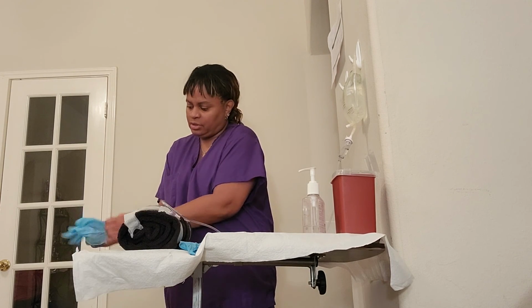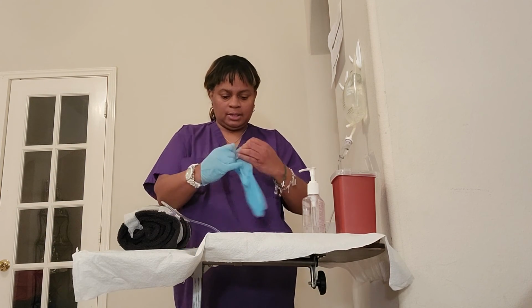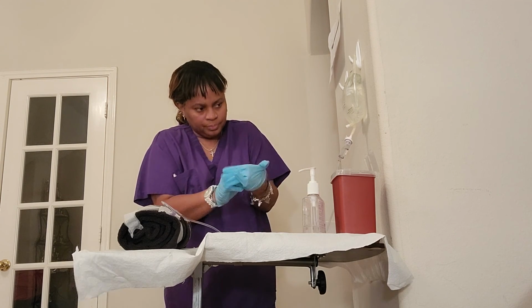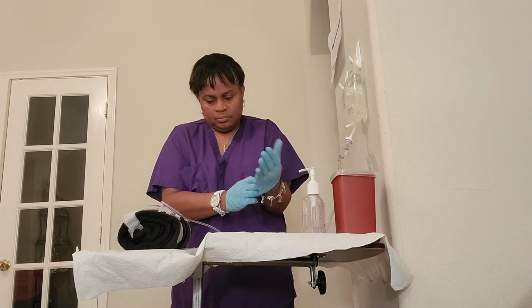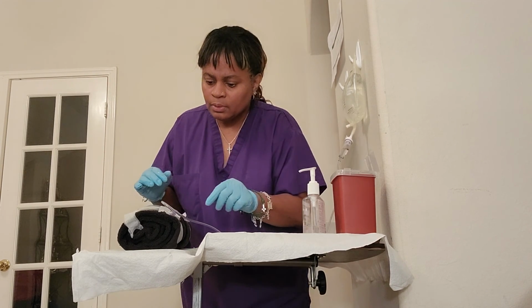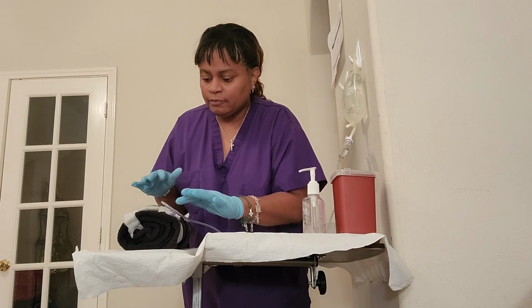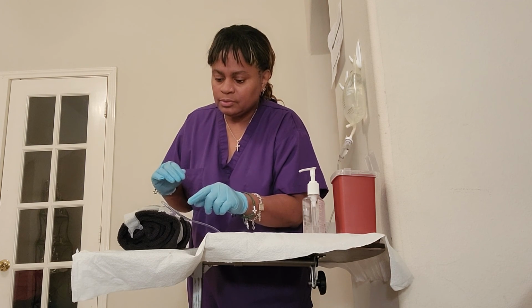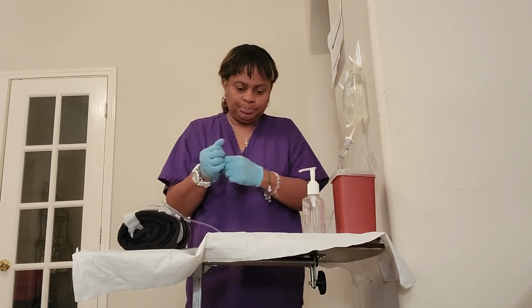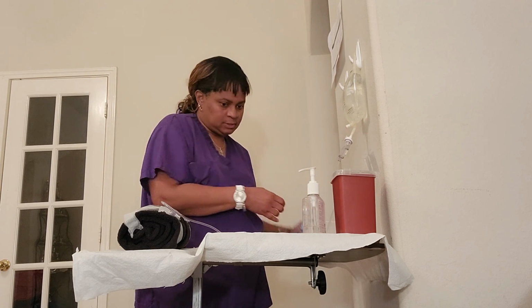I'm going to perform hand hygiene and assess the site again. There's no redness or swelling or any infiltration. Is there any pain? No pain. Great. Okay. So I've assessed her site. Removing my gloves. I'll perform hand hygiene again.